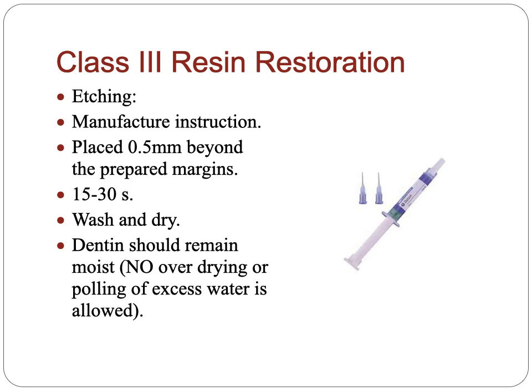So the first step is etching, as we say. We follow manufacturer instruction. We usually place the etching 0.5 millimeter beyond the cavity margin. We usually leave it for 15 to 30 seconds. Then we will wash the tooth structure and dry it.